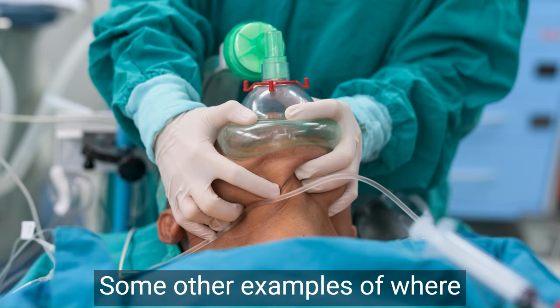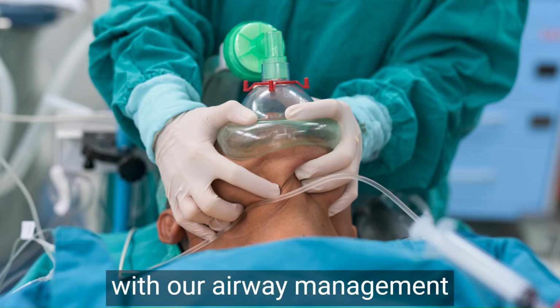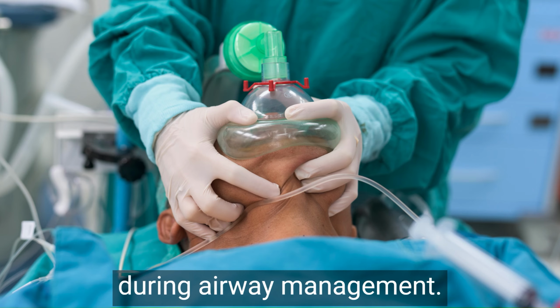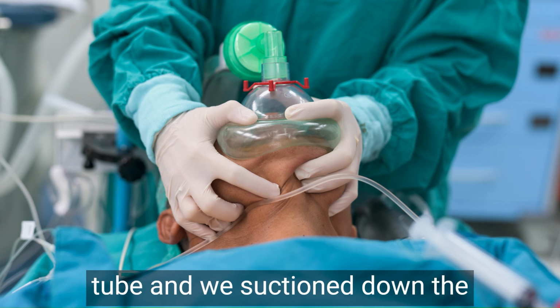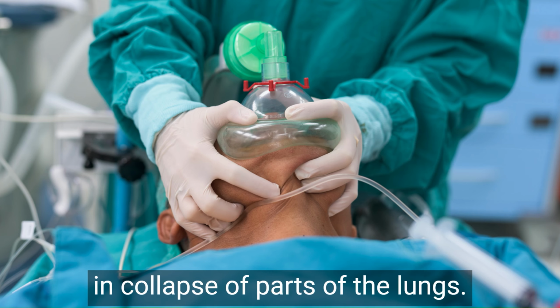Some other examples of where atelectasis or derecruitment may occur are if we struggle with our airway management and there are periods of hypoventilation or apnea during airway management. Also, if there are secretions in the airway or in the endotracheal tube and we suction down the endotracheal tube with a soft suction catheter, this will result in collapse of parts of the lungs.